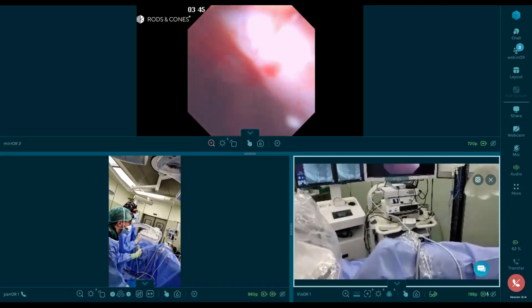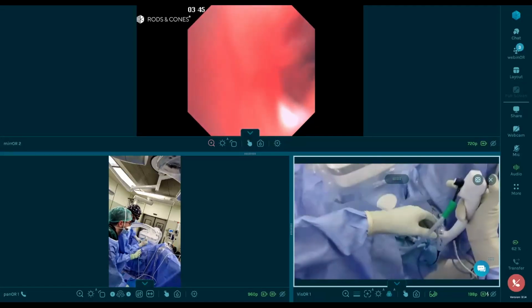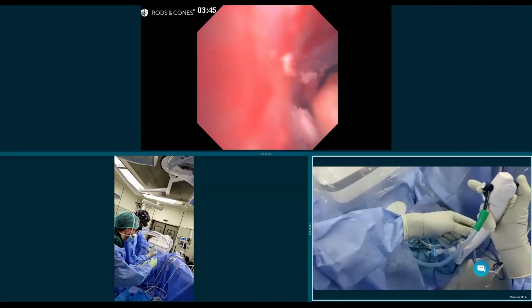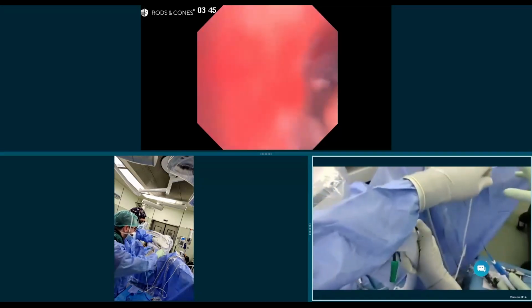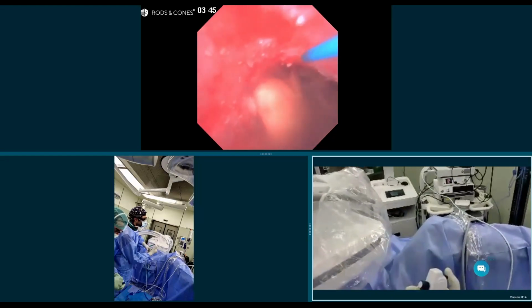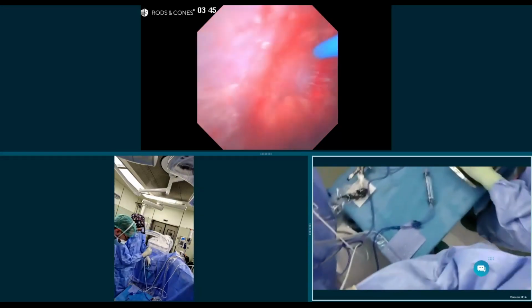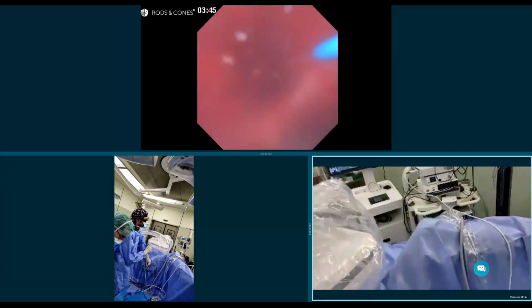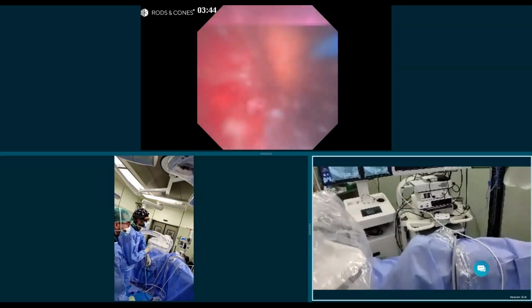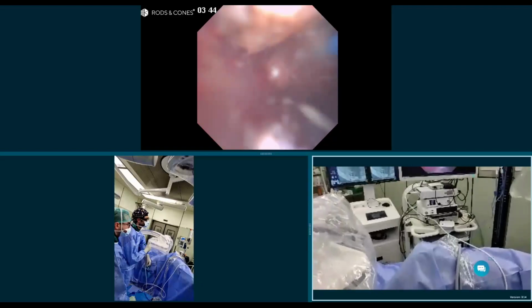In this case, this calyx here, as I mentioned, to increase my stone-free rates. The other important thing is that you are comfortable, because one of the most difficult stones to treat are inferior anterior calyxes, as this one. The ideal is to have a working channel that goes out in front of the stone, but otherwise it is good to relocate and for you to be very, very comfortable. So I'm going to put all the stones in the same calyx. This is something that I like also, to control that I'm dusting everything.